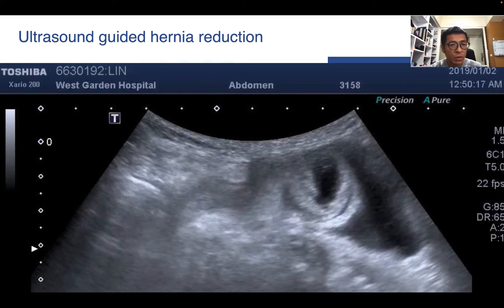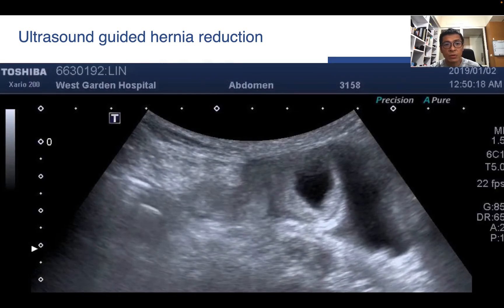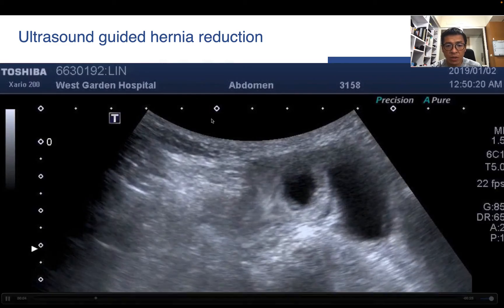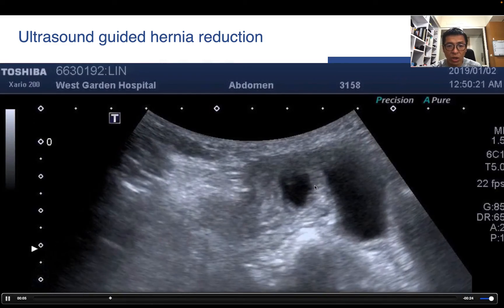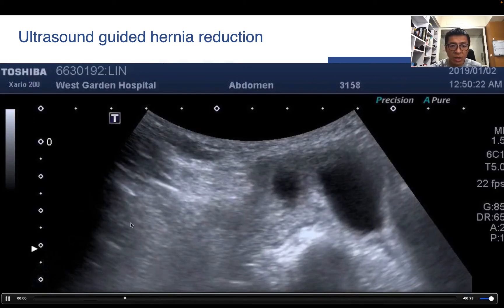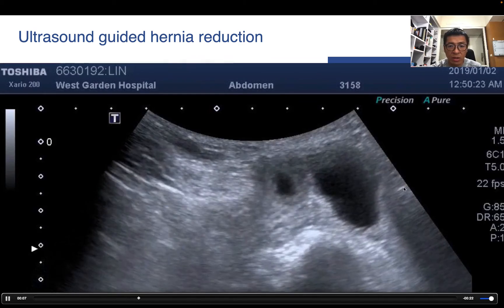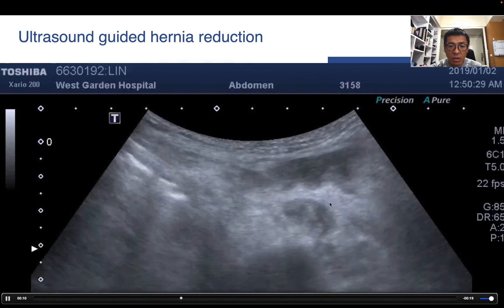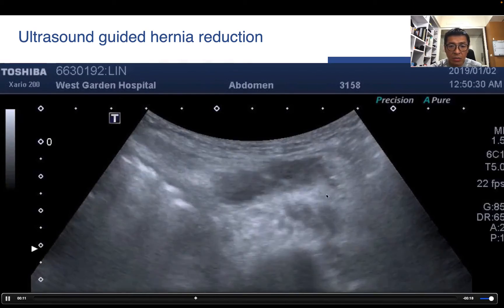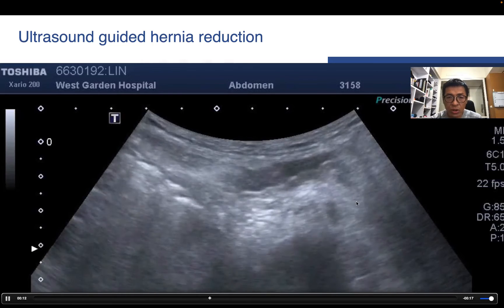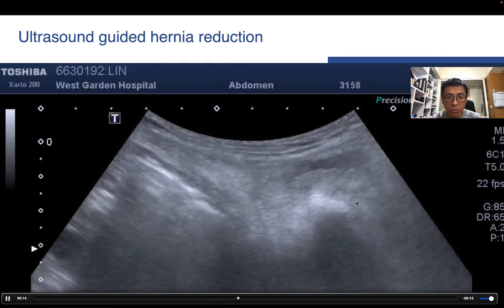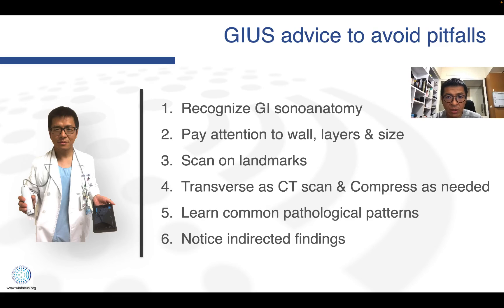Ultrasound is also useful to guide hernia reduction, especially when we understand its tract. Under real-time guidance, we can reduce the hernia into the peritoneum cavity.